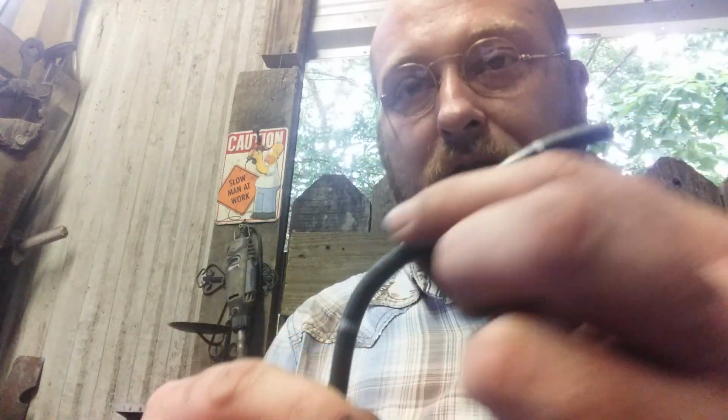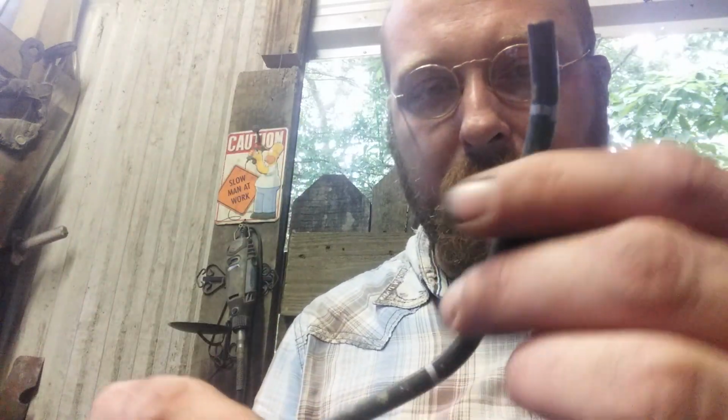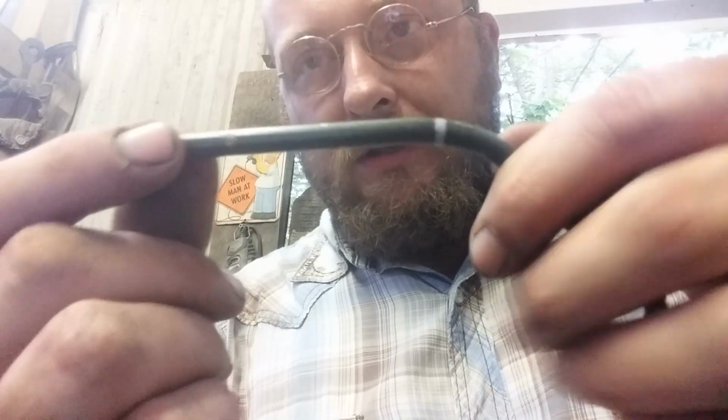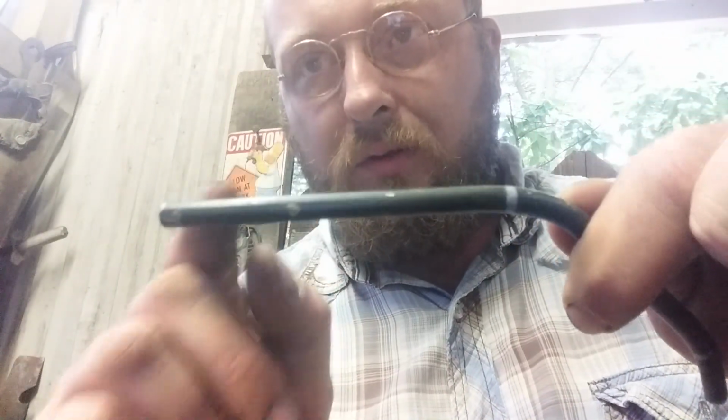I'm going to try to leave this portion round because I've got the idea to put some sort of gripping material on there. It would be not so bad to slide a rubberized material onto this round, and once I get the angle I want, I'll flatten a portion and drill the two holes in it so I can maybe get what I was after in the beginning.